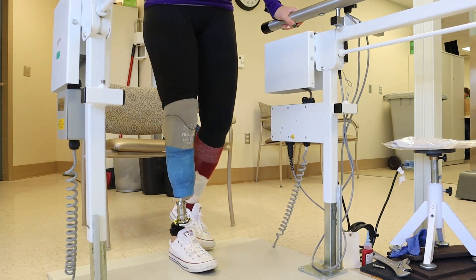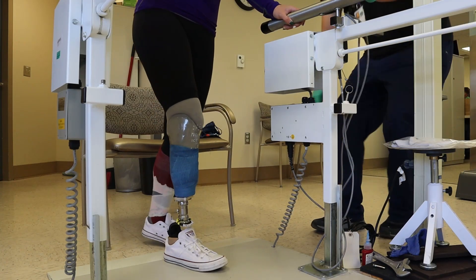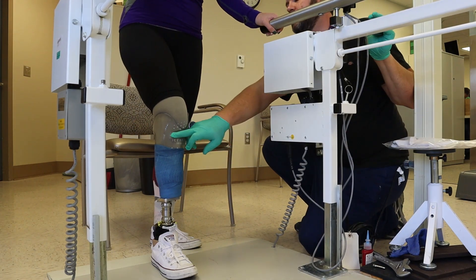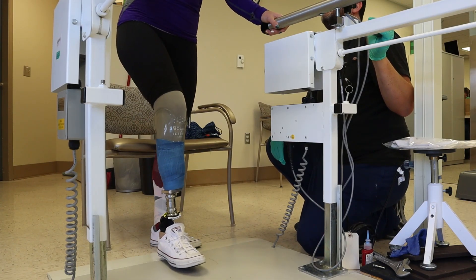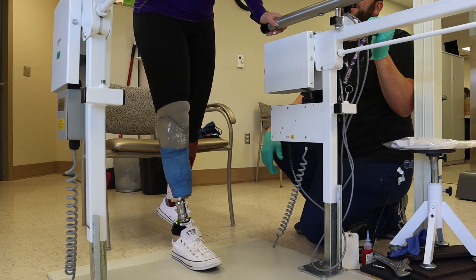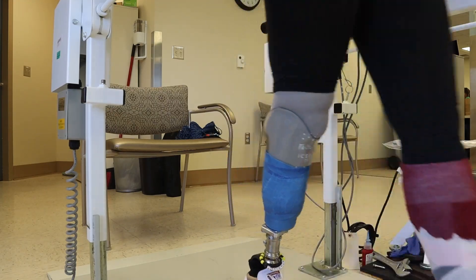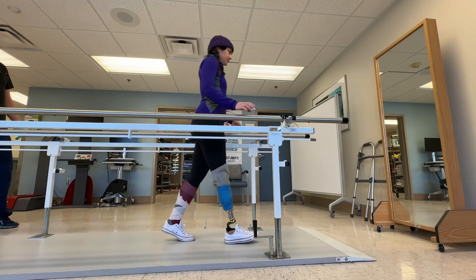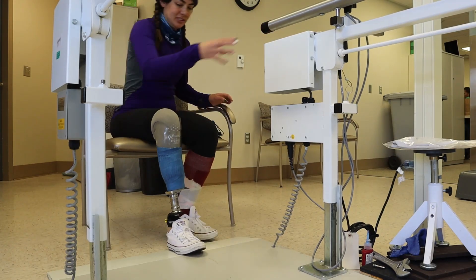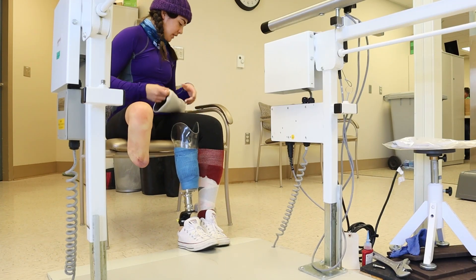Oh, I feel it. I don't like how it feels on the back. I can feel a lot of links. As they told me last time — soft tissue spillage, which is a really disgusting sounding phrase. How is this front part? Are you noticing that at all? I don't. I do like that the condyles are a little tighter. I tightened up the condyles. I increased the pressure right where you're saying you don't like it. So those are two things that changed for sure — one for two at this point. Is that uncomfortable enough? You want to stop and let me go adjust it? No, I'll walk a little bit. I feel like I'm slipping still a little. I'm going to take off this sweat sock because maybe that's what's making me slip. I ran out of my cotton one, so I'm using that one, which is not my favorite.